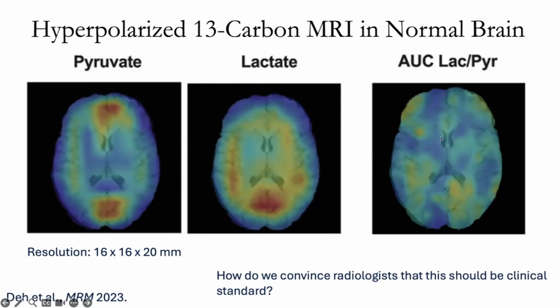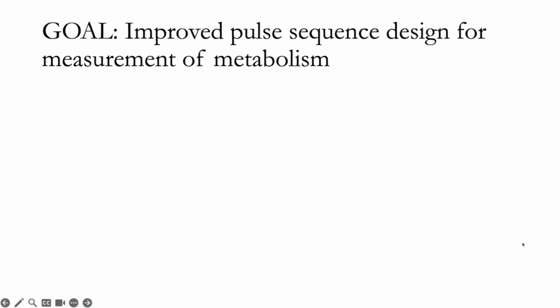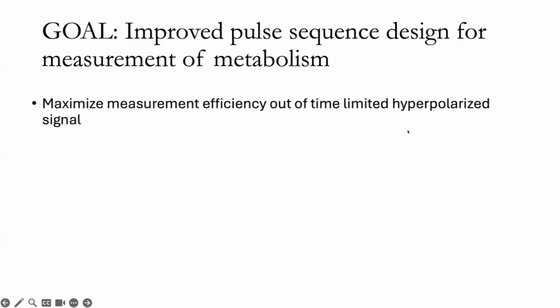But with this amount of signal variability between gray and white matter, even as advanced as the methods are these days, I think this still has a ways to go before the clinical neuroradiologists will be excited about trying this on all of their patients. So as a personal goal, this resolution and signal reliability is something I have been working on for some time now.